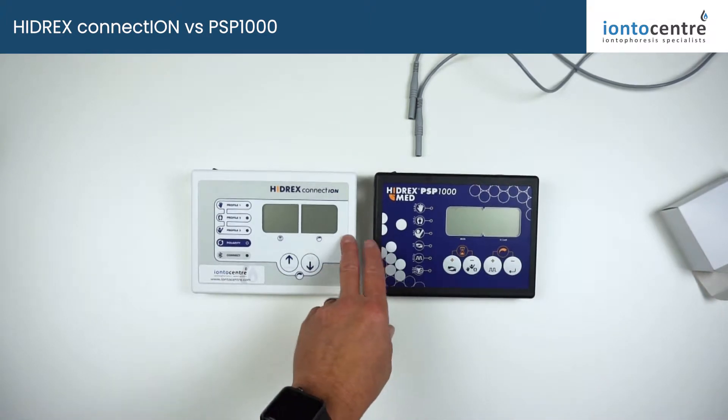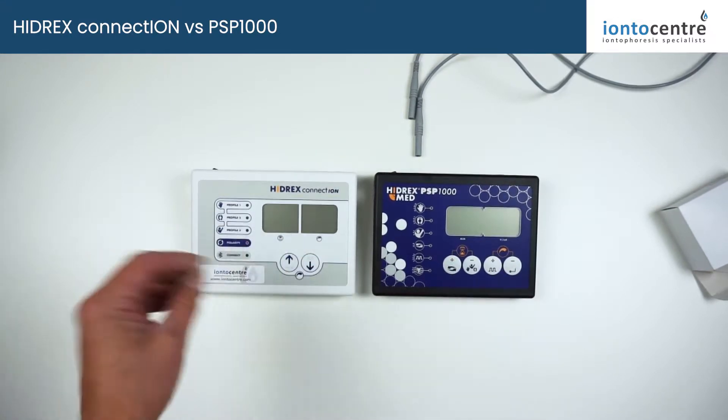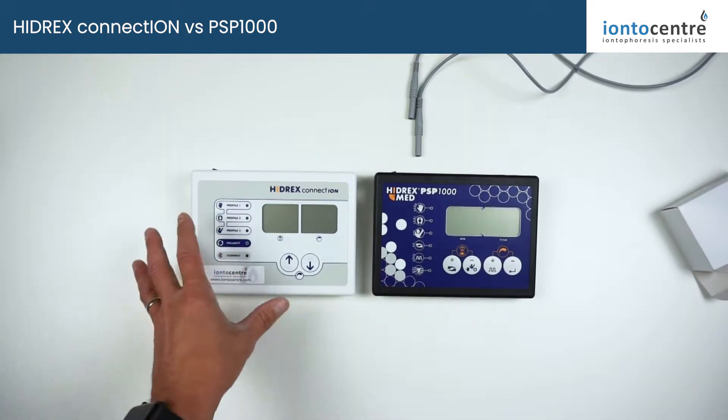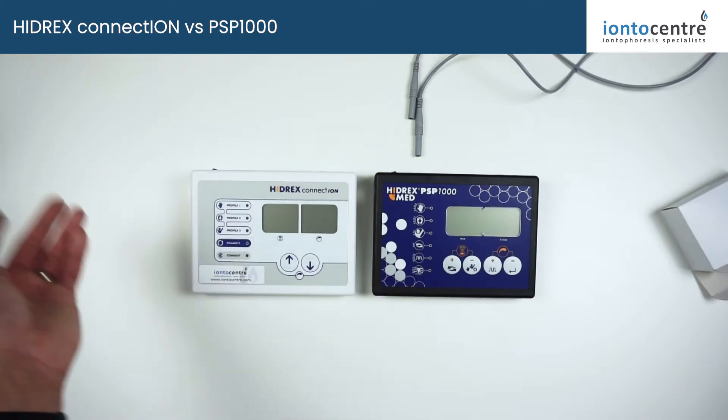This machine has direct current, pulse current, and also variable pulse current where you can adjust the on/off cycles for a much more efficient pulse current treatment. It's got automatic polarity switching so you don't need to worry about changing electrodes, changing direction of current flow, or pausing midway through.